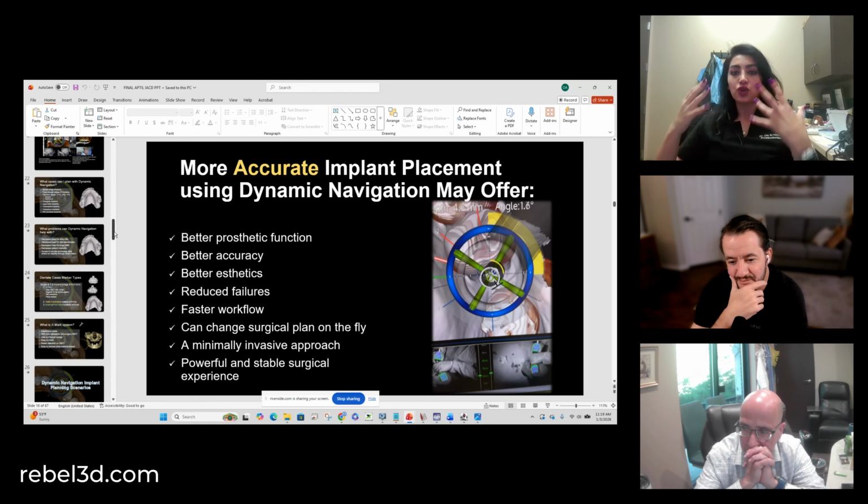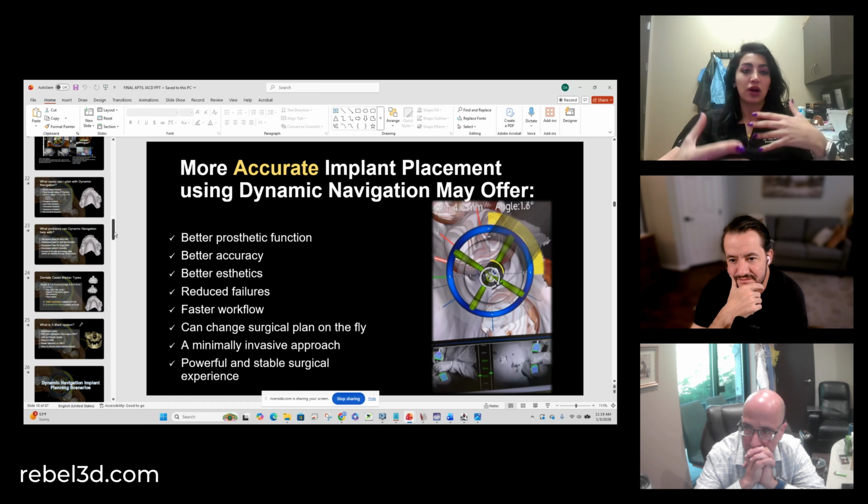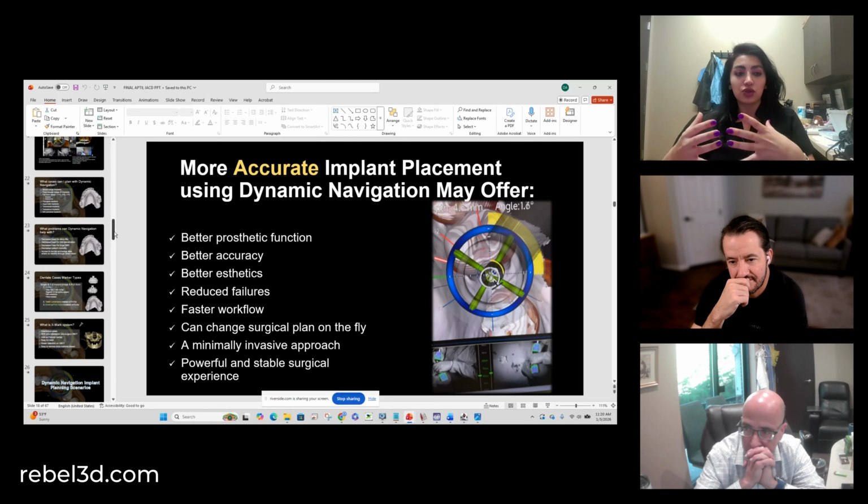You don't want to do your implant planning, place the implants, and have the teeth exit from the implants in a position that the patient and you have not agreed on. I know a lot of clinicians that just go freehand on the day of surgery without any discussion of those kinds of expectations with the patient. And this is usually what causes issues down the line. So setting realistic expectations, in my opinion, is very important.